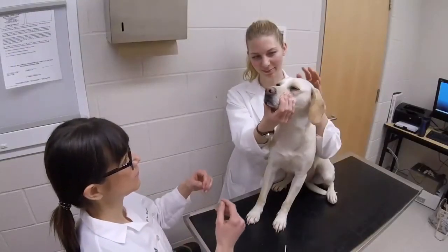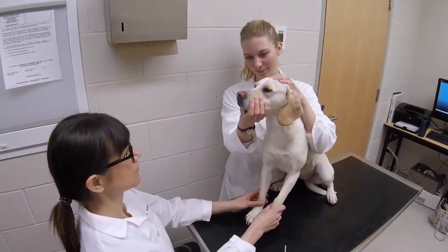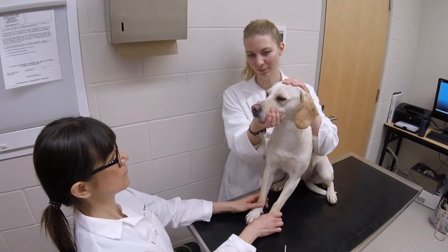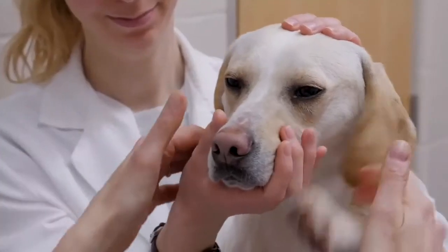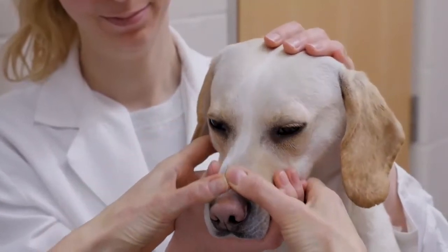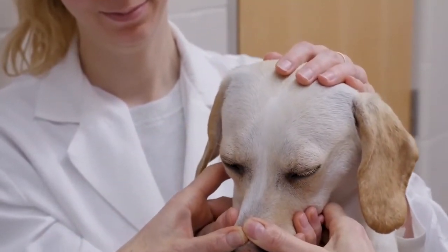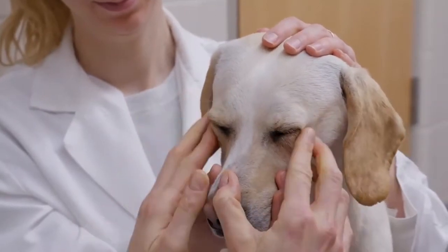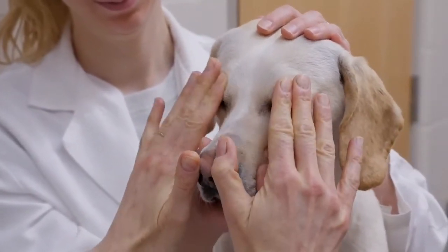We begin with examination of the orbit and gradually move posteriorly in the globe. For orbital examination, the symmetry and position of each globe is evaluated closely from varying angles, from directly central, top, and from the side of the animal. This is followed by palpation of the orbital rim.